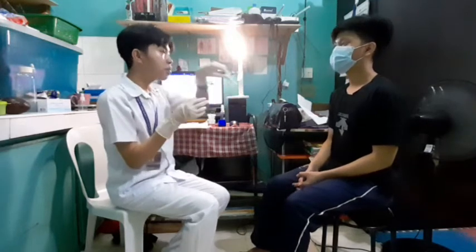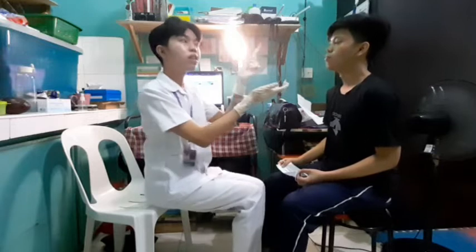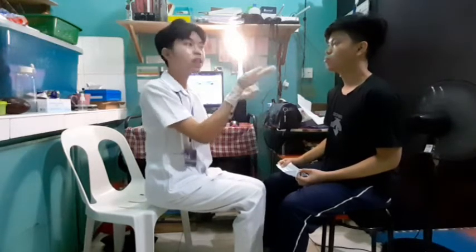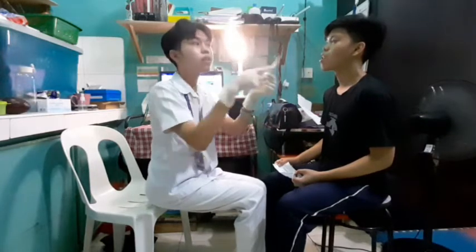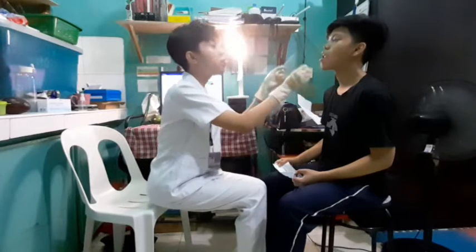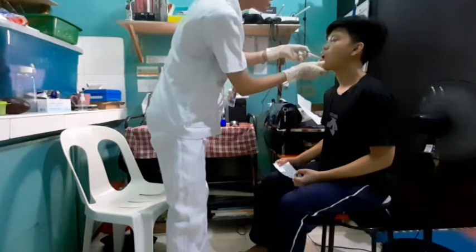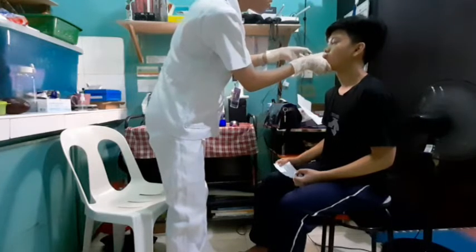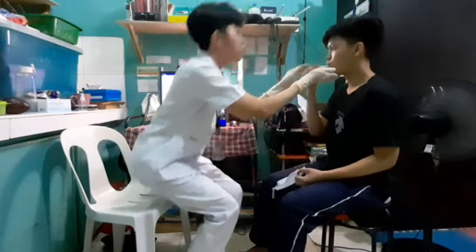I will now start the oral temperature. Can you please remove your mask? Can you please open your mouth? For inserting the thermometer, first let the patient open his mouth. Can you please lift your tongue? We will be placing the probe of the thermometer under the tongue — we can see the frenulum, and on either side we can place it. I'll turn it on. You can close your mouth. I will wait according to the manufacturer's instructions — at least one minute to elicit the temperature. Can you please hold the thermometer? We'll just wait a minute.